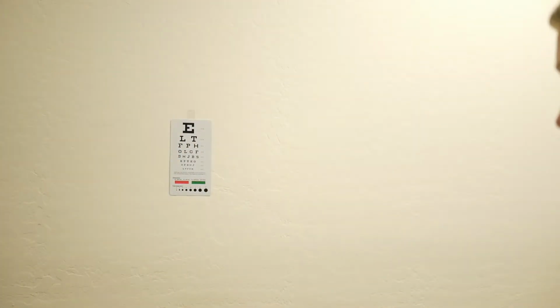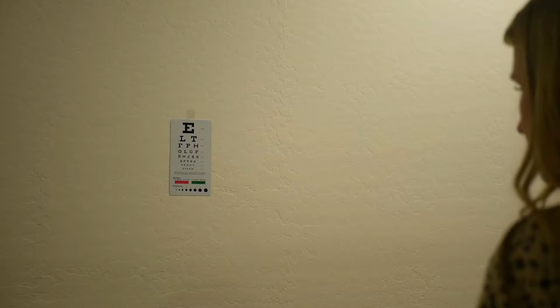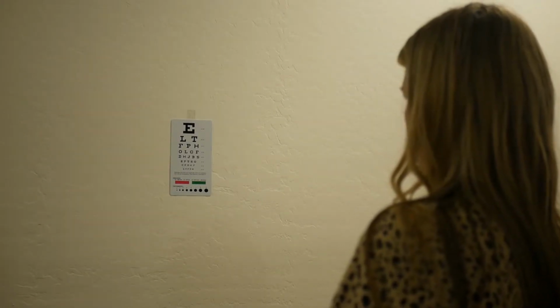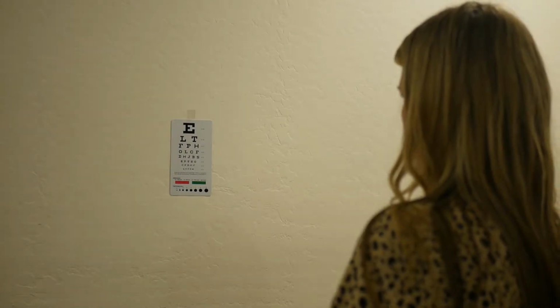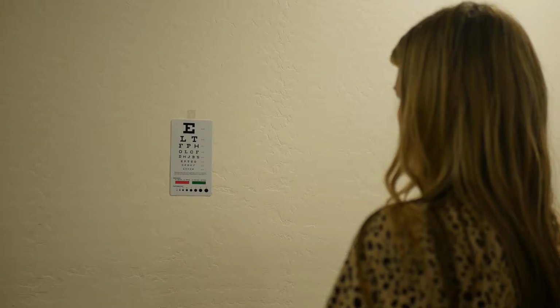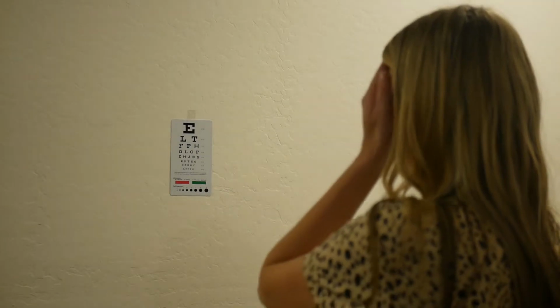The first test of visual acuity is the Snellen test. You're supposed to have them stand 20 feet back from the chart. Our chart is much smaller. It says 6 feet back, but it works the same. So, Ms. Marshall, if you could please stand 20 feet back from the chart and read the lowest line that you can before the letters become too obscured for you to be able to read. But first, cover your left eye.